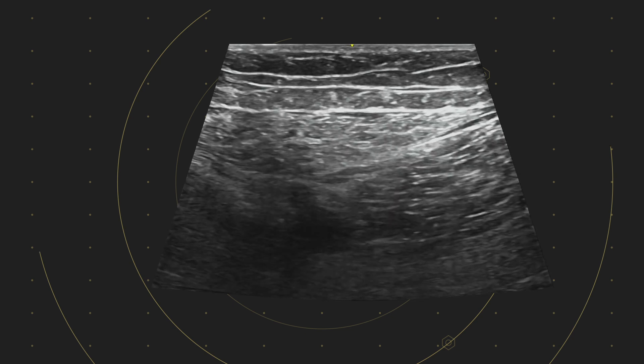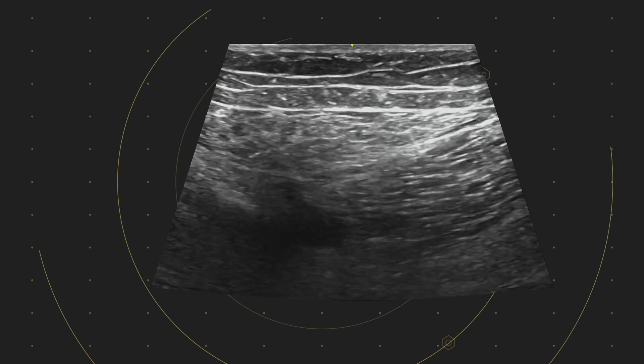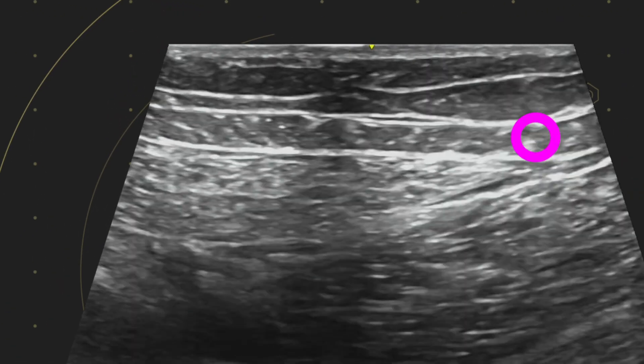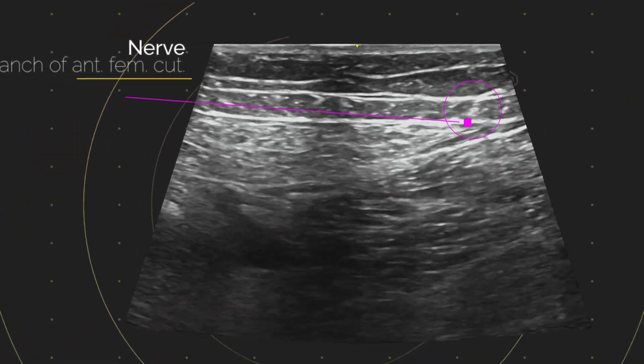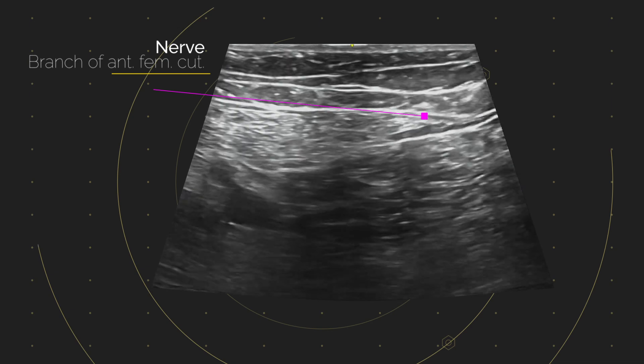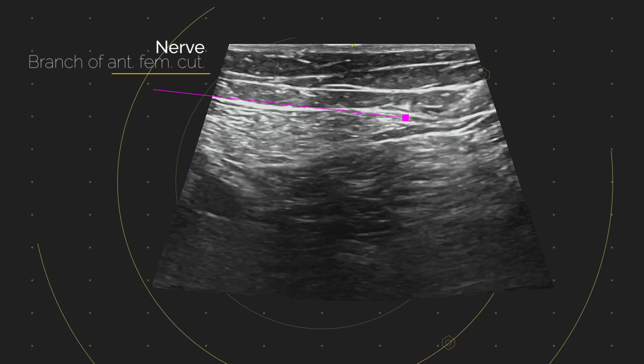The needle's coming in and we've stopped, having appreciated that this hyperechoic dot might be one of the branches of the anterior femoral cutaneous nerves. So we have to decide: do we go above or below on our path towards the saphenous? We're going to go below.